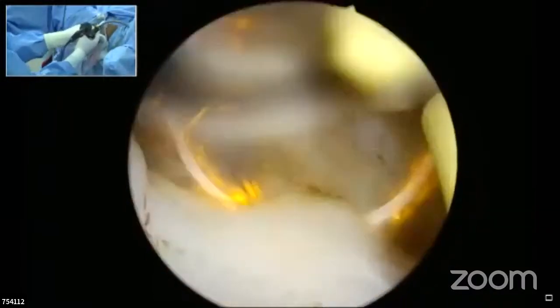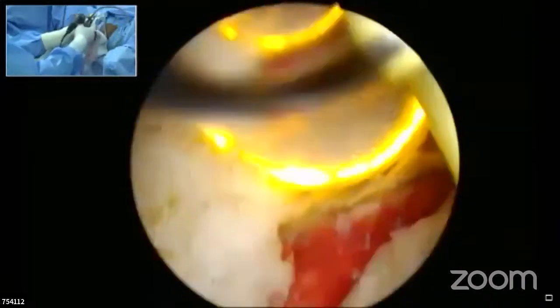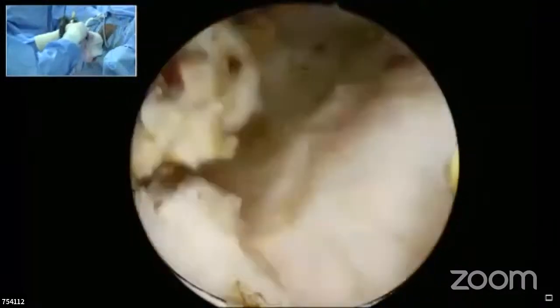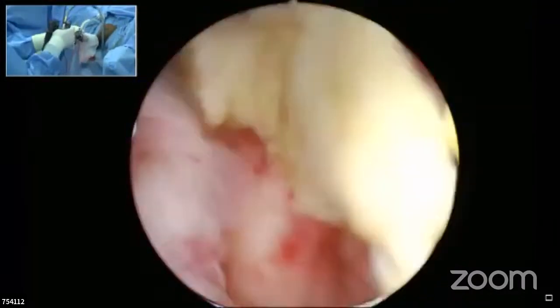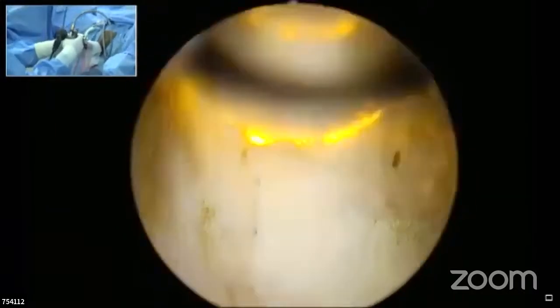I may lower my cutting power settings from 120 to 110 if I'm using a monopolar, and if I'm using a bipolar, I won't make a difference. I'll continue to use the same settings.